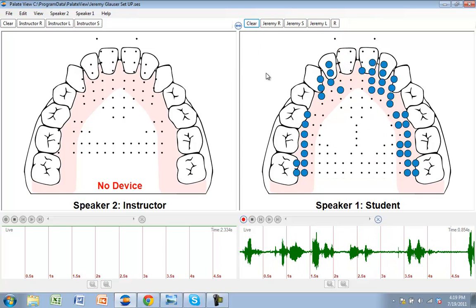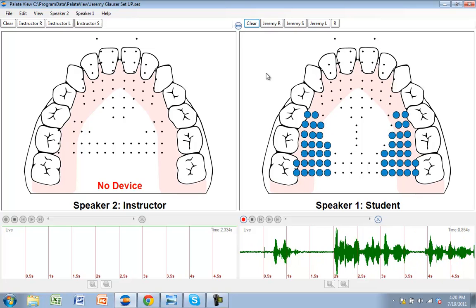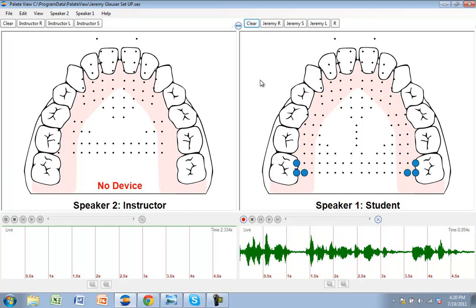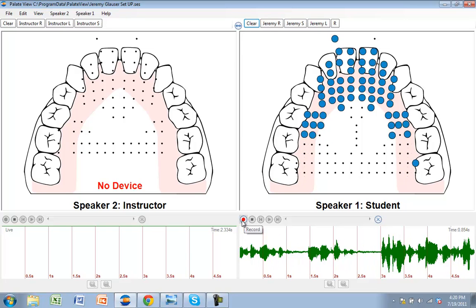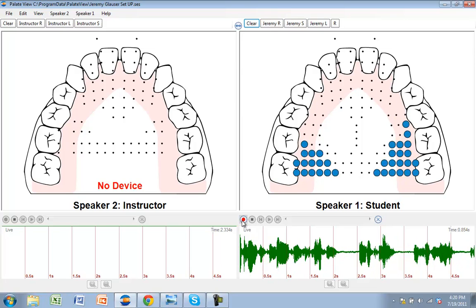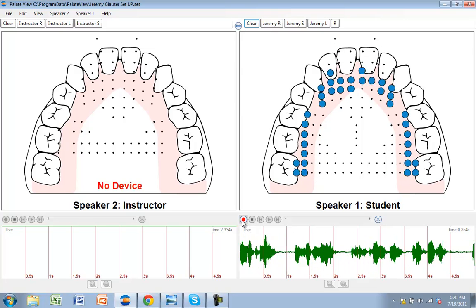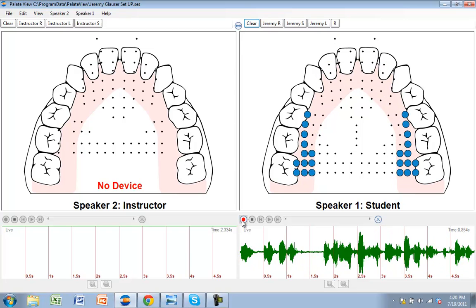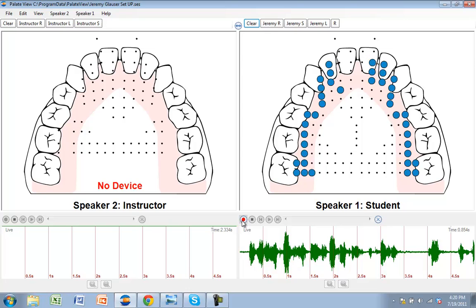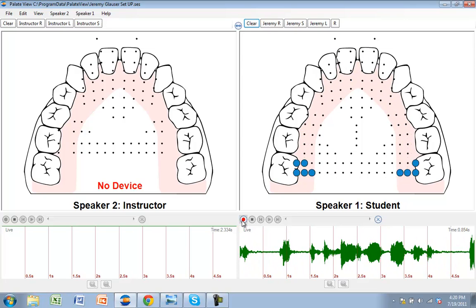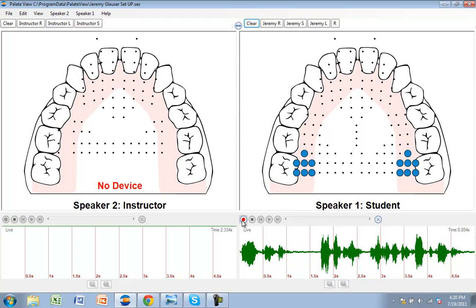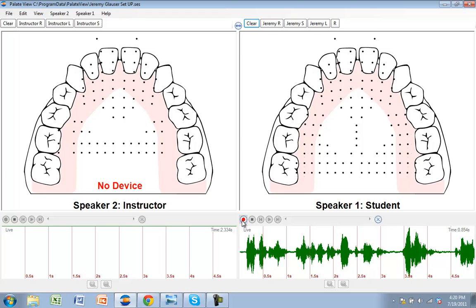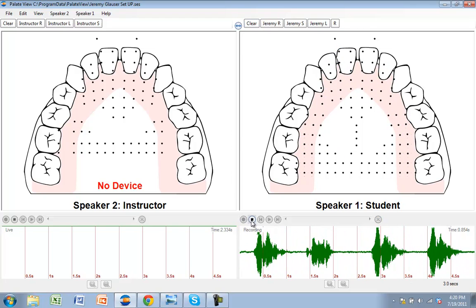Let's say that you're having a hard time just catching a target during spontaneous speech, or during practice. What you can do is come down to this waveform and record a certain word, a certain carrier phrase, and then play it back. And it not only records the waveform, but it also records the placement that takes place during that word or carrier phrase. I'm going to press the red circle and record a carrier phrase, red riding hood. Red riding hood. Red riding hood. I'll stop it.